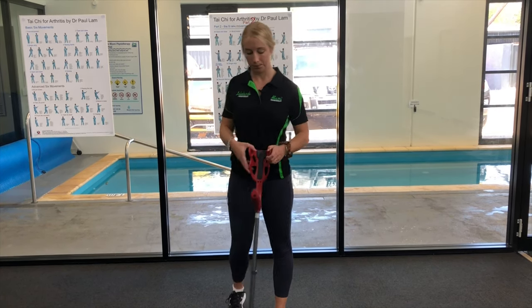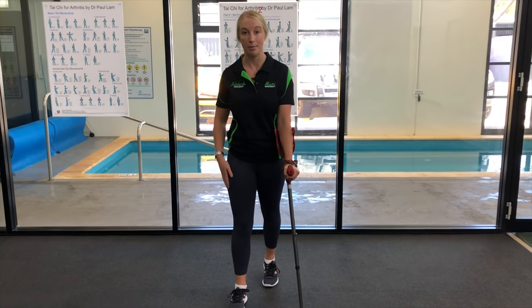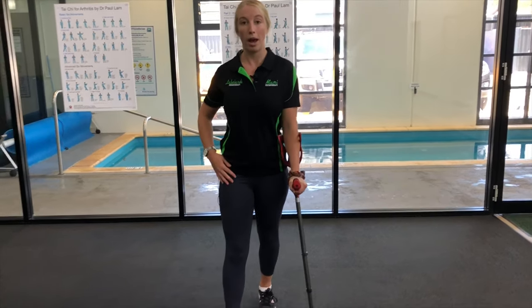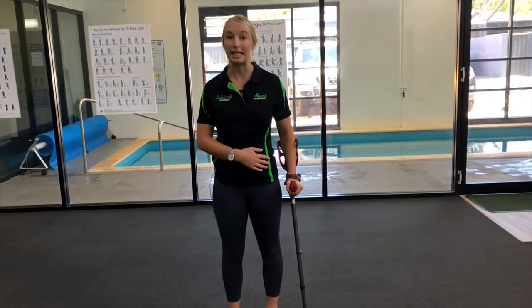So let me show you. Popping it in the opposite side, we're going to walk at the same time, putting the stick down at the same time as the leg and then step through. It's going to keep our weight nice and even so that we can walk more normally and stop ourselves from getting any limping habits.